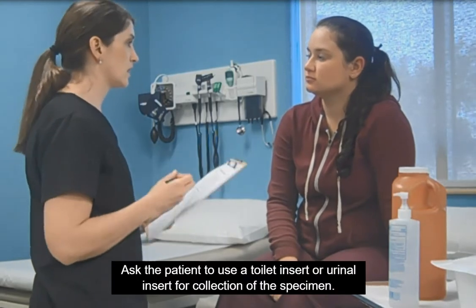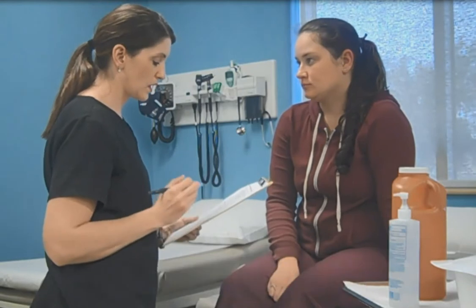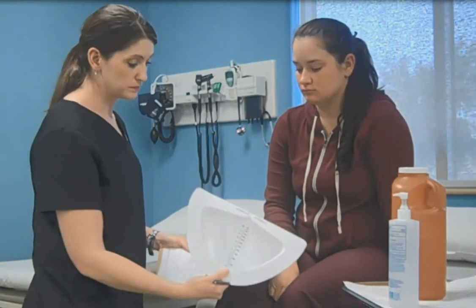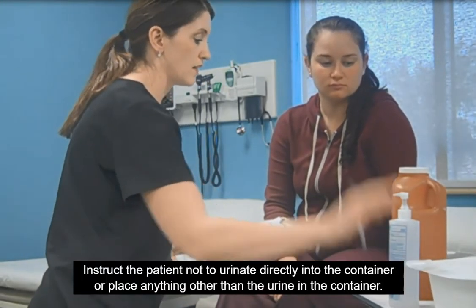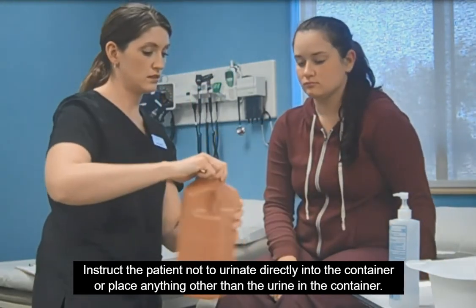Ask the patient to use a toilet insert or a urinal insert for collection of the specimen, then to pour the urine into the 24-hour container. Instruct the patient not to urinate directly into the container or place anything other than urine in the container.